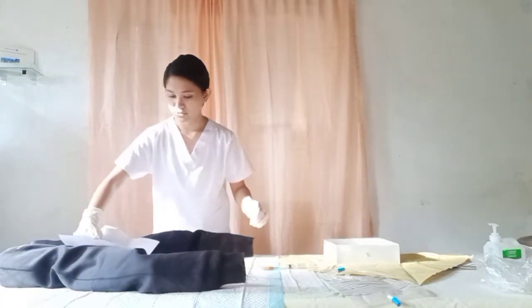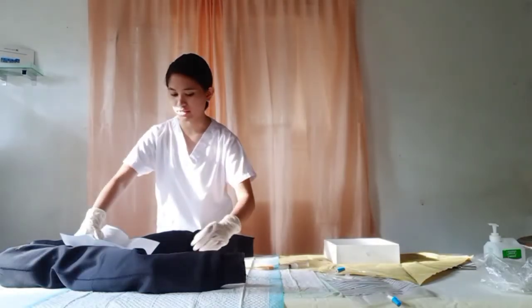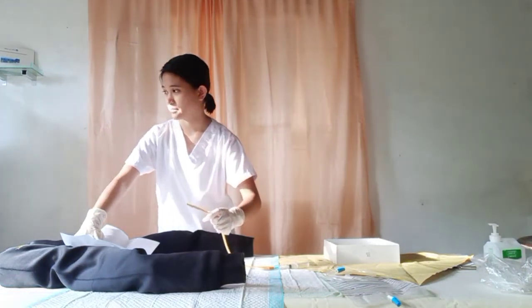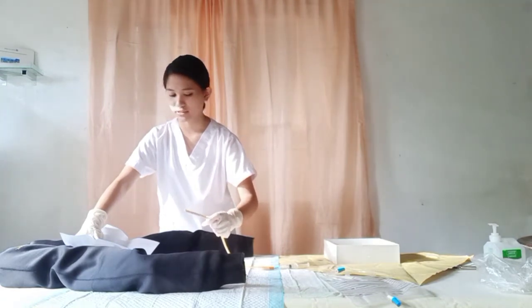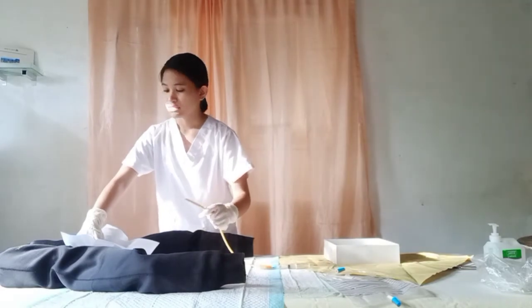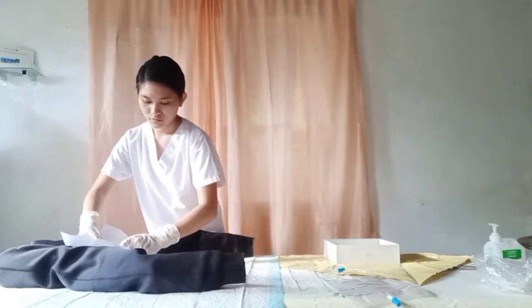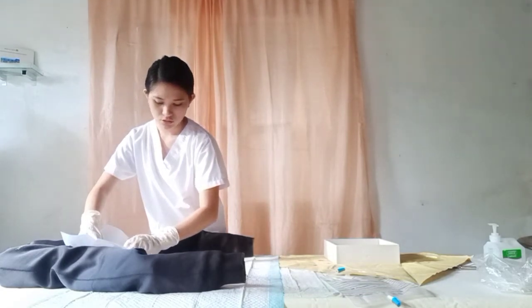Okay, Mrs. Cruz, I'm now going to insert the catheter. This time I need you to take a deep breath and then exhale slowly as I insert the catheter. Now inhale, exhale. I'm now inserting the catheter. Wait until the urine flows in the tubing.